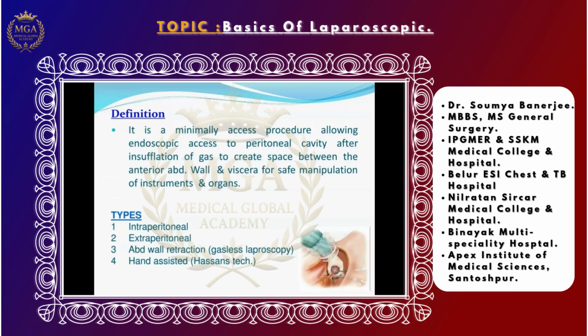Our today's topic is the basics of laparoscopy. Now, obviously, you have to understand what laparoscopy is. It is a minimal access procedure that basically allows endoscopic access into the peritoneal cavity.